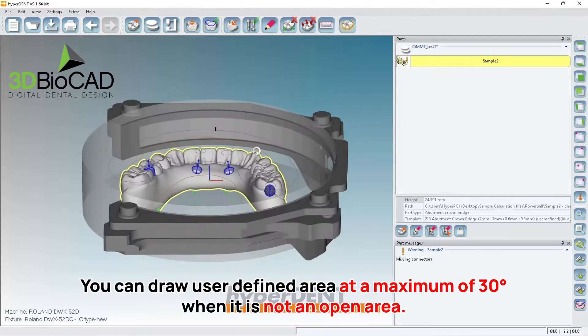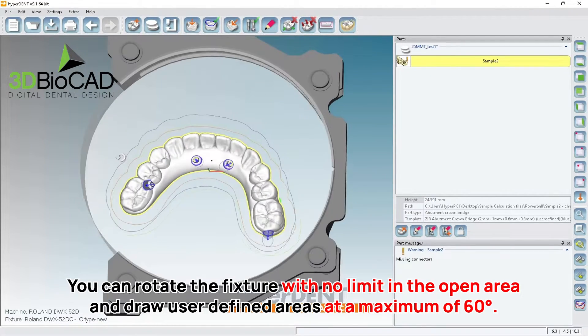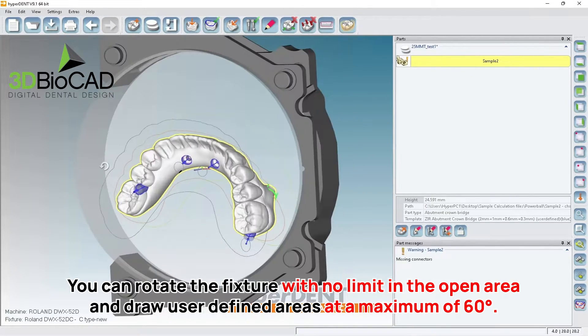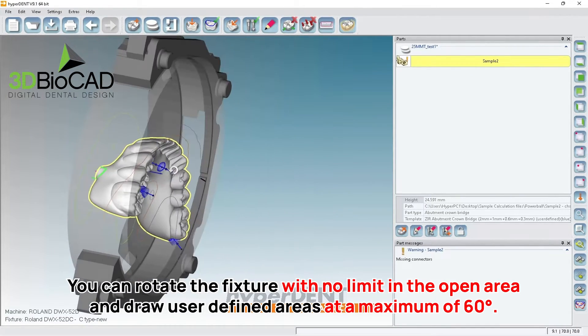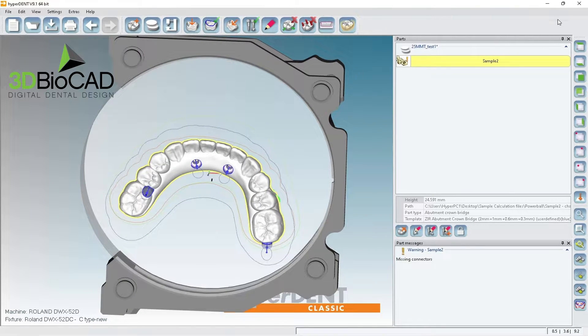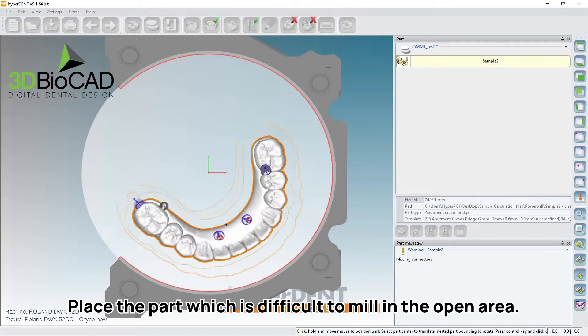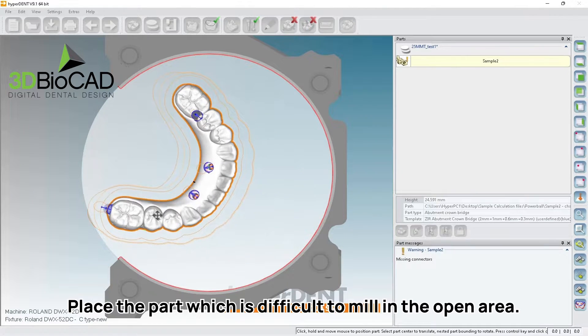If I tilt this way I have no limit. For user-defined I can go up to 60 degrees. So I'm going to bring this crazy angle over here — let me make it simple.